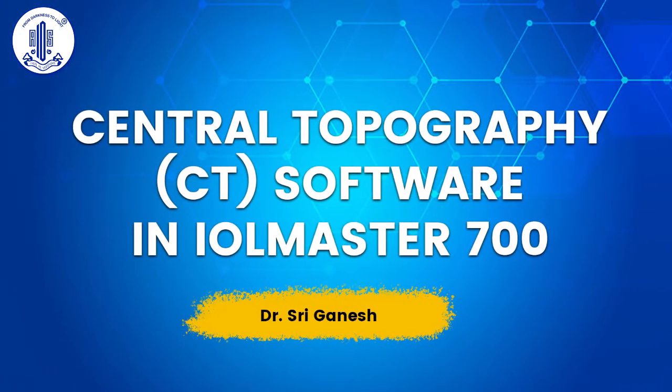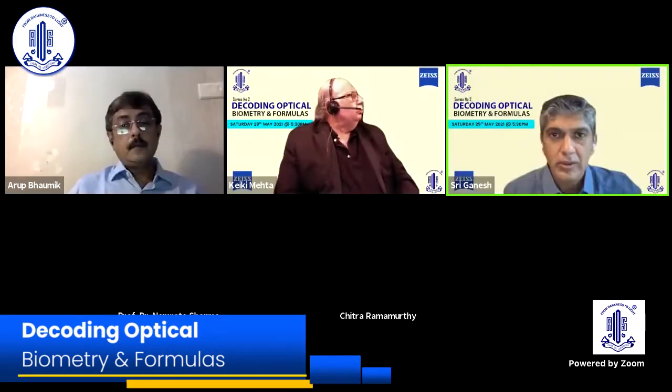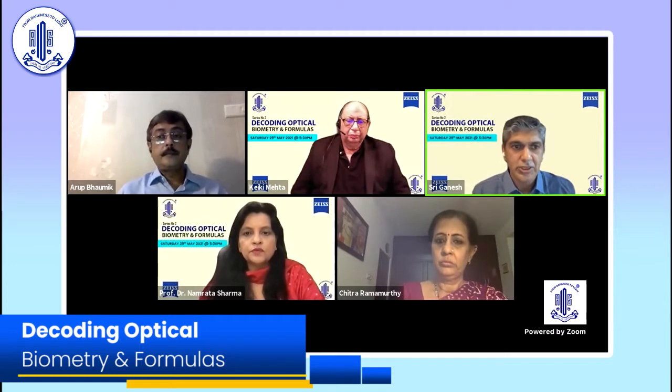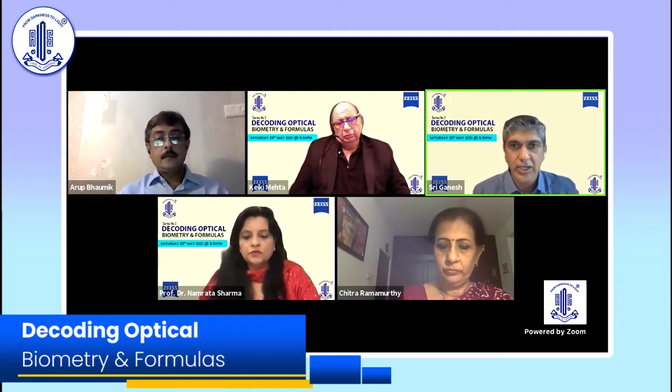We'll go on to the other topic again. I think I'll share those slides. Sorry, which is the new development in the IOLMASTER 700. I'll just briefly talk about it.